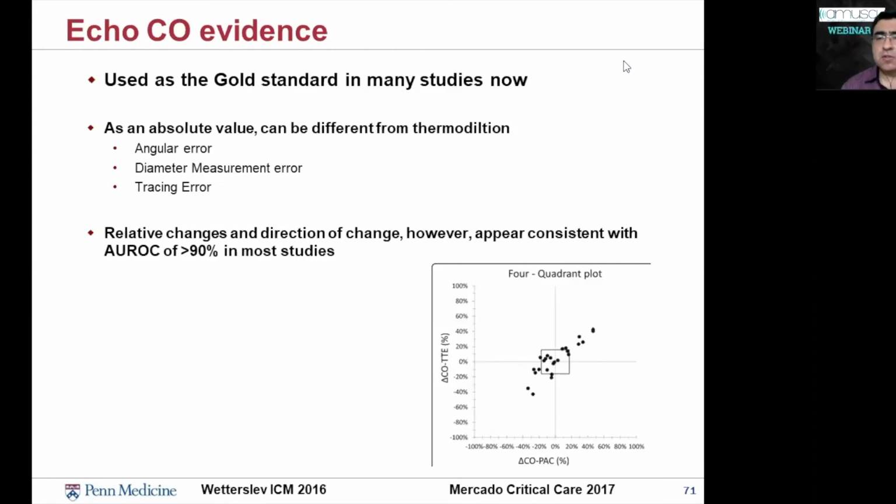Yes, it's true. Cameron, speaking about the overlap of shock, in some patients we can see a very low ejection fraction, but maybe this is a chronic situation, and the patient will respond to volume. Even though the patient has a very low ejection fraction, it is a chronic condition, and the patient is undergoing a hypovolemic shock, isn't it? Exactly. Hypovolemic or distributive shock with impaired ejection fraction is really common, and unfortunately is often mistreated because we are afraid to give fluid to somebody with an impaired ejection fraction.